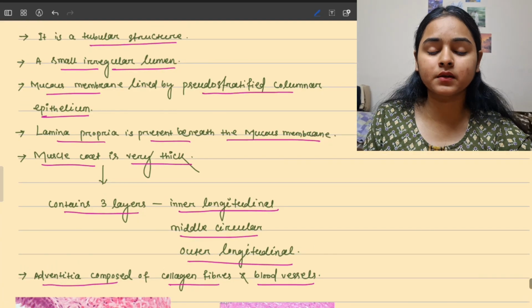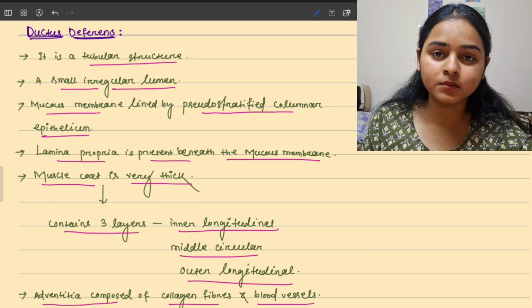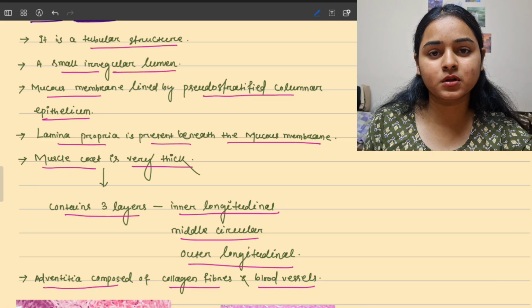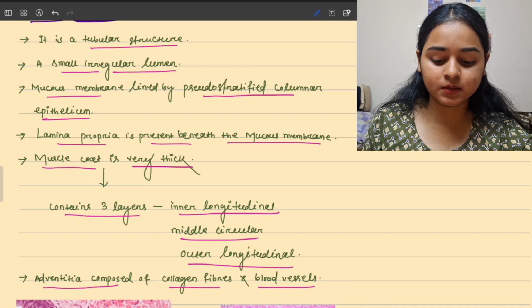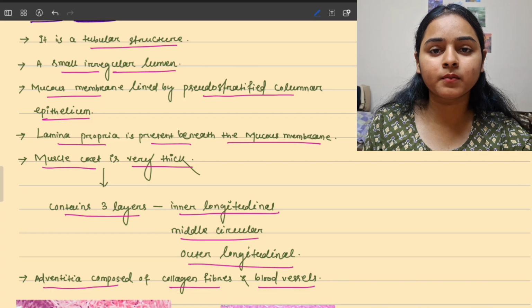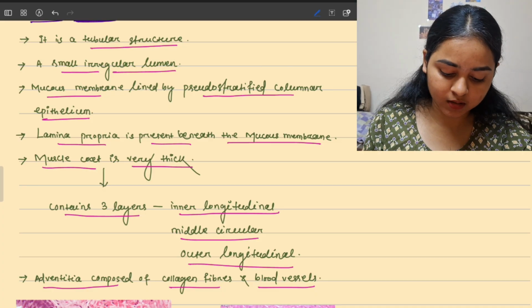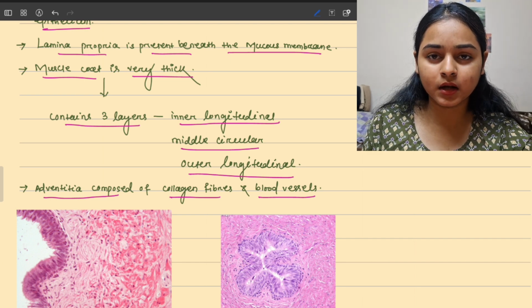Okay, so what are the characteristic features of vas deferens? You have to identify the pseudostratified columnar epithelium in the lumen, and you will find a lumen. That is the most important thing. You have to identify lumen होगा slide में, और in the mucous membrane it will have pseudostratified columnar epithelium, and another important feature is the muscle coat, because the muscle coat of vas deferens is very thick. इतना थिक मसल कोट तुम्हें और किसी स्लाइड में नहीं मिलेगा. ओके, सो यू विल इजीली आइडेंटिफाई फ्रॉम these 3 points, that is the muscle coat, the lumen, and the epithelium.